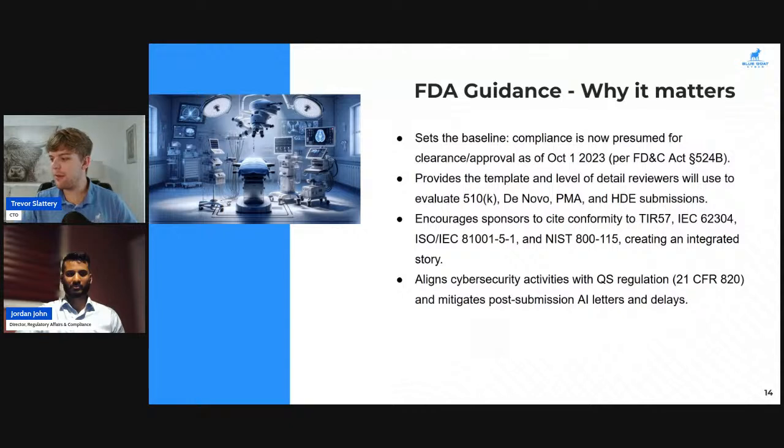Now, we can jump into some of the most recent changes, which has been the buzz on everyone's mind lately. I know that previously, a complaint that just about everyone's had with this FDA approval process is clarity around some of these items. And so the FDA recently just pushed out Section 7 of this guidance document talking about quality considerations for cybersecurity and medical devices. And what Section 7 is doing is clearing up the definitions on what is a cyber device. What are some examples of a cyber device? When is this documentation going to be required? When should a resubmission be required?